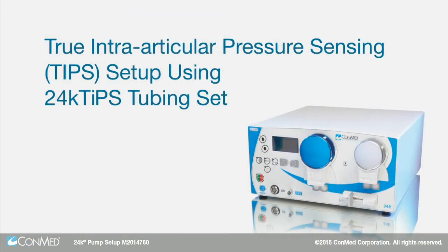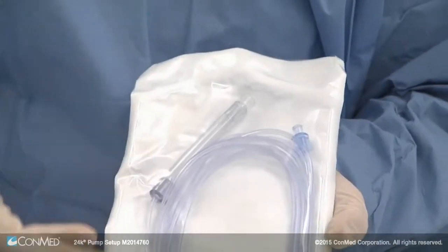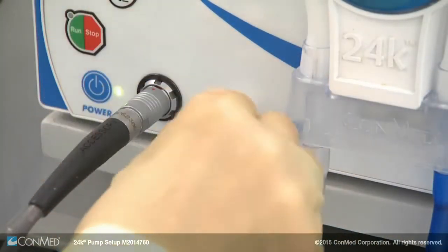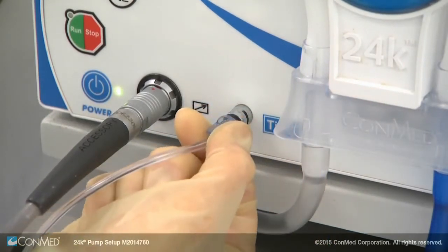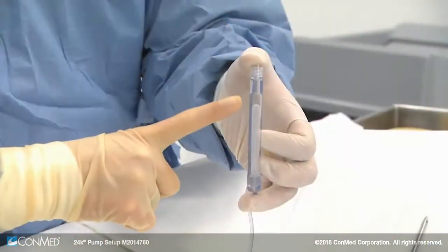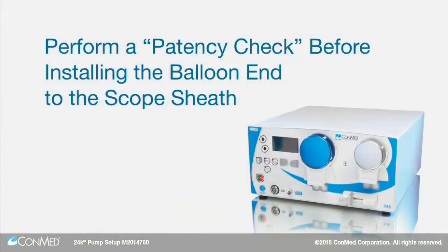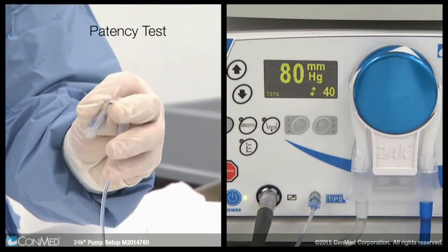To measure pressure inside the joint, install a 24K TIPS line to the pump port first by twisting until snug. The other side of the TIPS line features a tube with a balloon inside, which traps air and sends accurate pressure readings to the pump. Perform a patency check before installing the balloon end to the scope sheath.